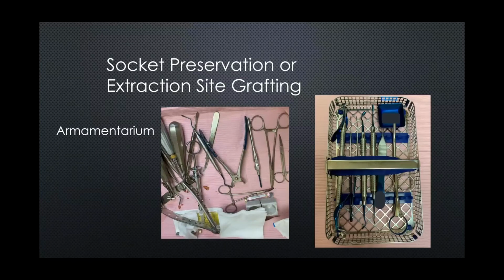Okay, just as an aside, keep your armamentarium nice and clean and neat. It's a reflection upon you as a surgeon and what we do.